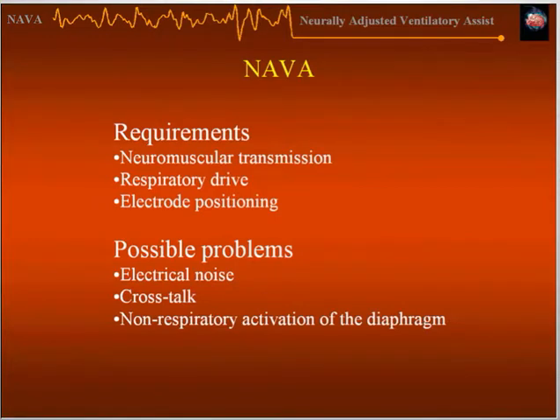Now, what are the requirements? The time does not allow me to answer all the questions, but you need neuromuscular transmission, of course, you need a respiratory drive, and you need to position the electrodes. Possible problems: electrical noise, crosstalk from other muscles, and non-respiratory activation of the diaphragm.